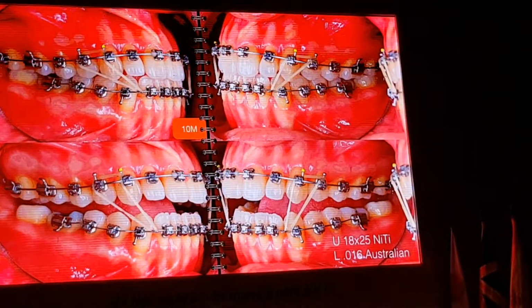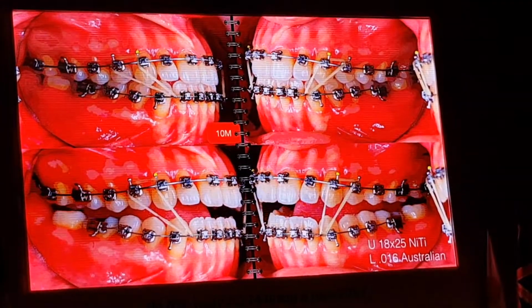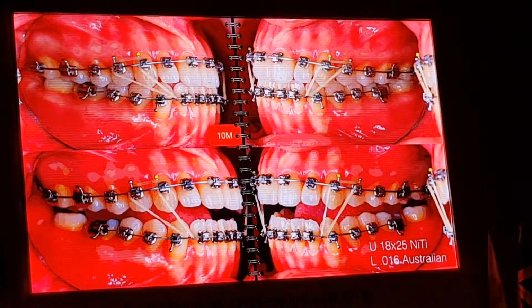So here you can see now I change to light class 3 triangular elastic to help me to settle the occlusion between canine and premolar.